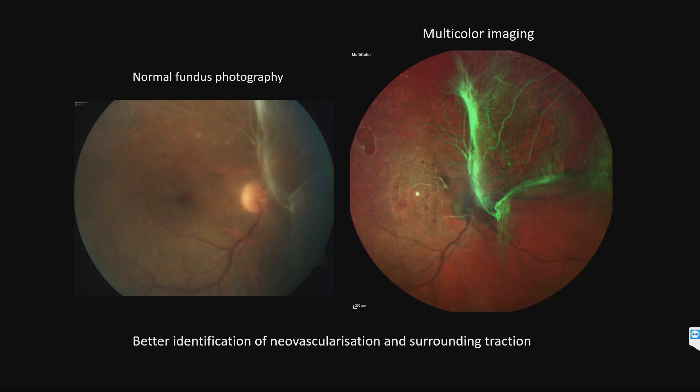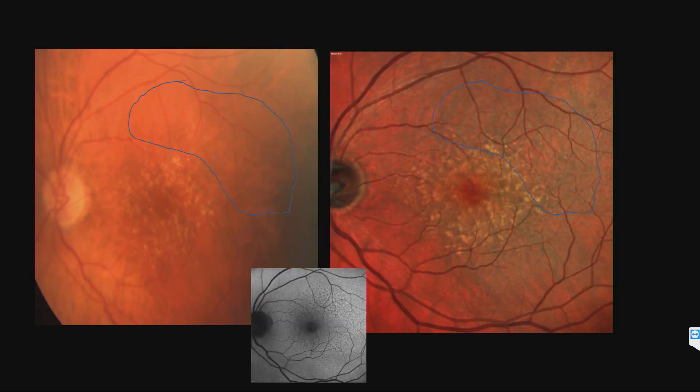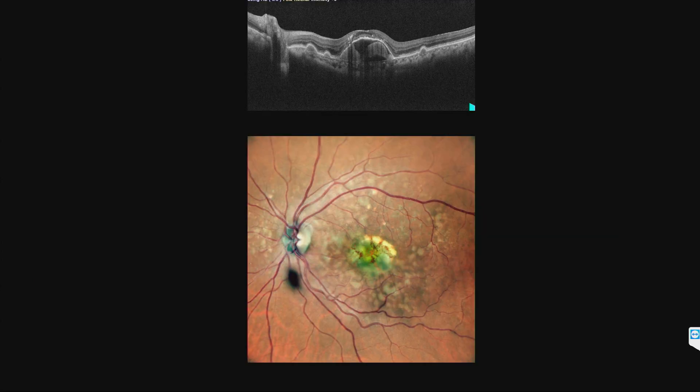In dry AMD, we know reticular pseudodrusens are predisposed for new vascular growth, so we need to identify them. Multicolor imaging picks up these lesions much better than conventional photography. You can see the target-like lesions in the multicolor imaging. Drusens are better made out, the margins are well defined. For following up a case of dry AMD, multimodal imaging is of good value.